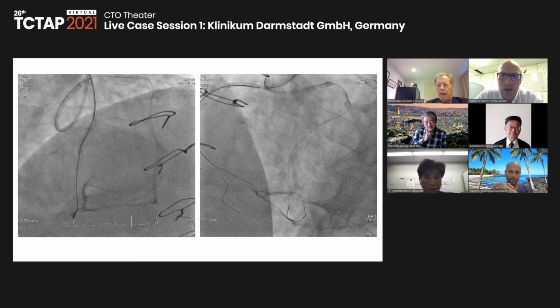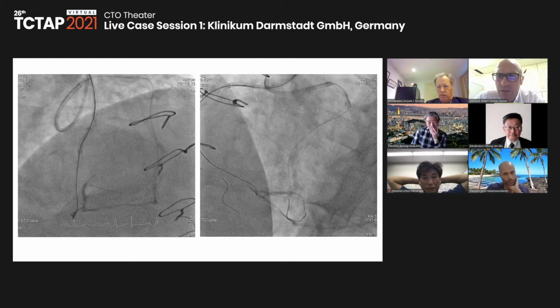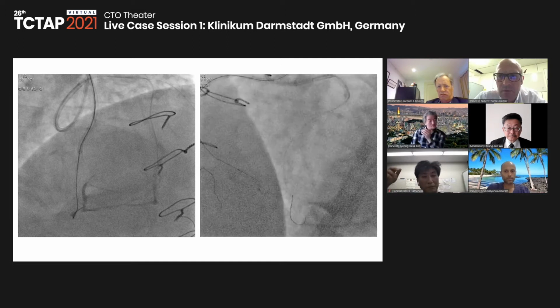And what is your plan? Does the CT help? Regarding CT, you've had such beautiful CT imaging, and there's a Siemens person there. Did the CT of the distal right show that sort of trifurcation type? I mean, does the CT help again for us?